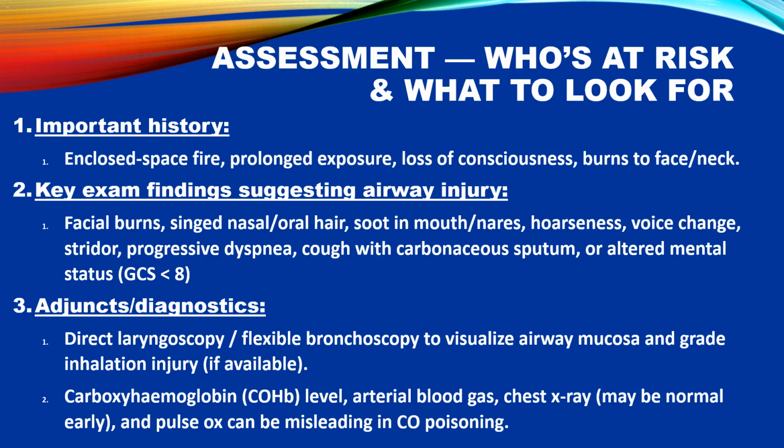3. Adjuncts, diagnostics: direct laryngoscopy, flexible bronchoscopy. These procedures can help visualize airway mucosa and grade inhalation injury.